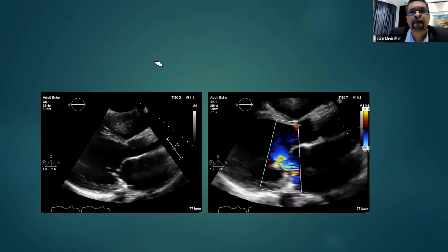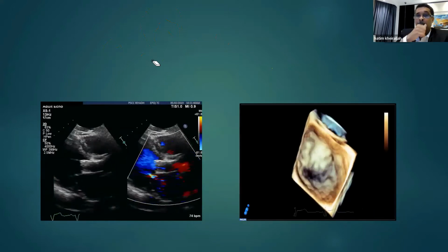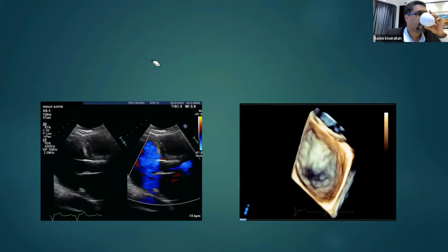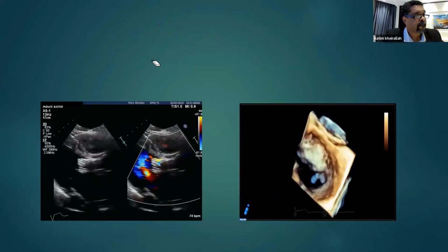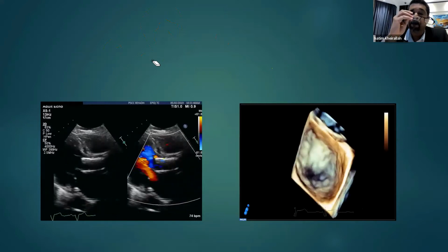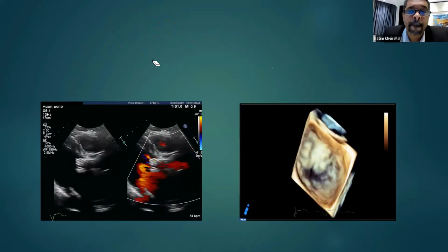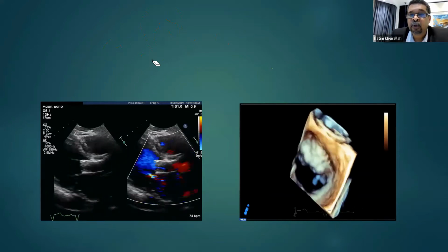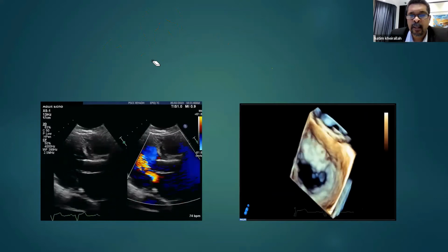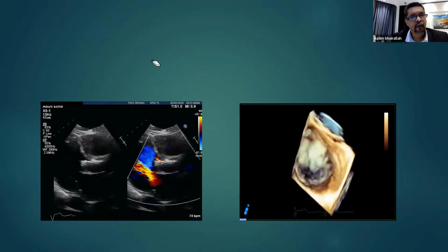Okay, we go further. Now, what do we see here? Any guess? Anna, I want you to be familiar with the new procedures and the persona of the new valves.